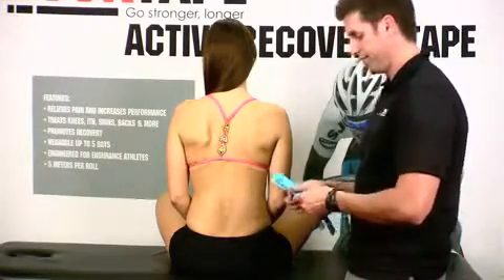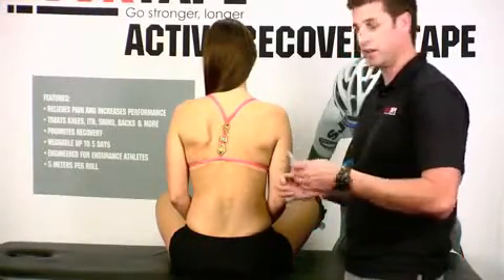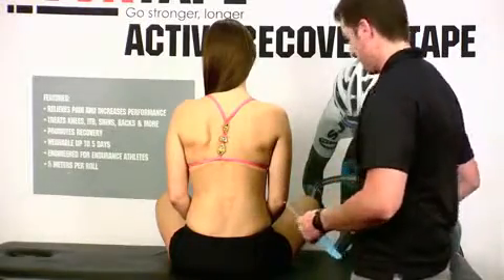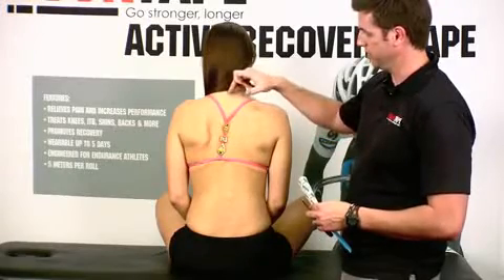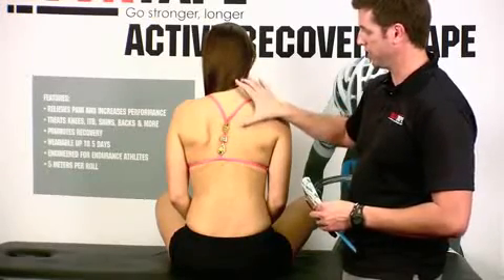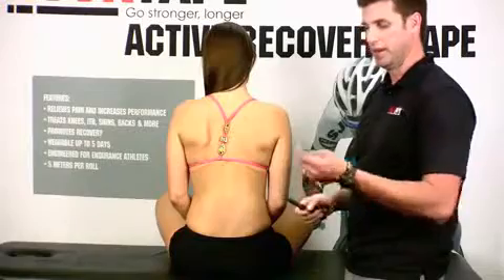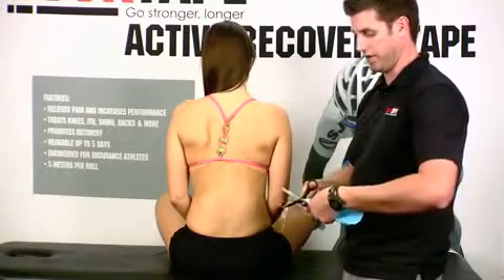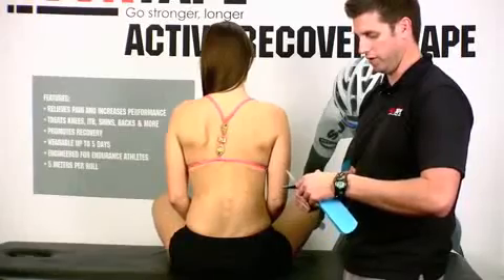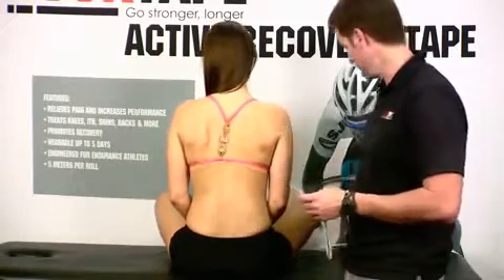I've already taken the liberty of measuring out and cutting tape to length, but when you do that you want to make sure you're going to cover the entire area creating pain. You want to make sure this whole area is covered. You want to round the corners — it's going to prevent any rolling when wearing clothes or even sleeping at night. Do both sides.